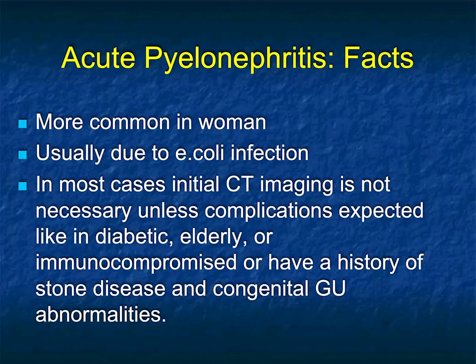Most of the time when we're doing pyelonephritis on CT, it's a patient who has known pyelo, who has been treated but is not doing well and continues to be febrile, and you're worried about complications like abscesses, or in patients who are diabetic or elderly or immunocompromised, where you worry about more severe infections. So it's the more unusual cases, the more cases where you expect complications, that we will be doing CT scanning.